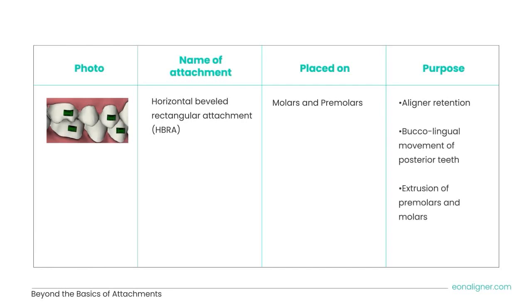This is usually placed on molars and premolars and serves multiple functions, first of which is aligner retention. It is also needed when applying buccolingual movement of posterior teeth and for extrusion of premolars and molars.